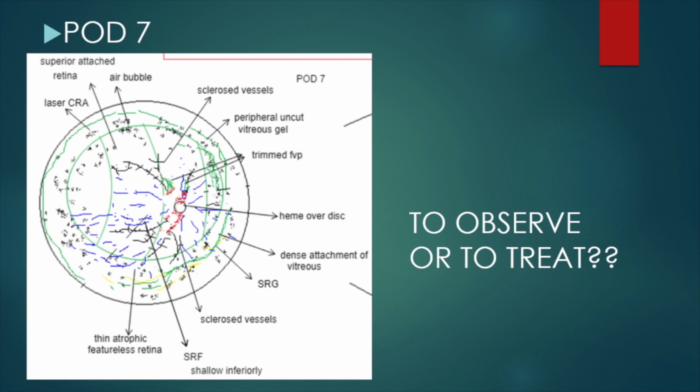Basically we had released the traction, so the retina was mobile. Intraoperatively, we could not find any break on the table. So assuming it was just released traction and a mobile retina, with no rhegmatogenous component, we used only an air bubble. That air bubble was also used because one of the bleeders was temporarily tamponaded. On the 7th post-op day, maybe because of sitting, or partly other components, the SRF was more inferiorly.